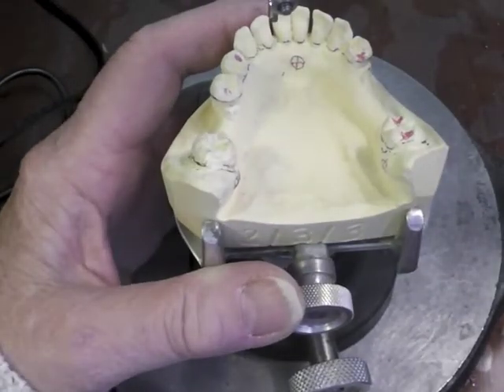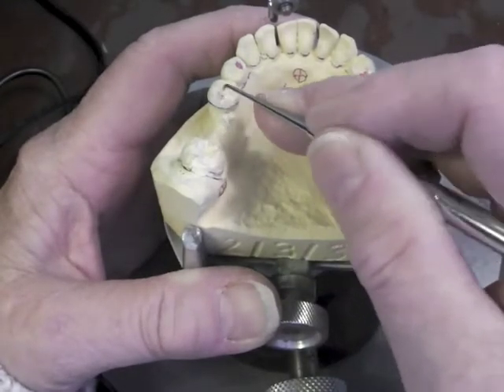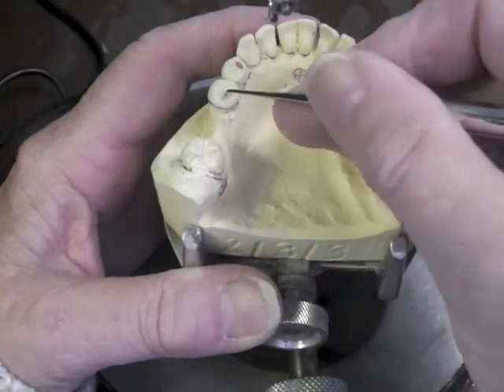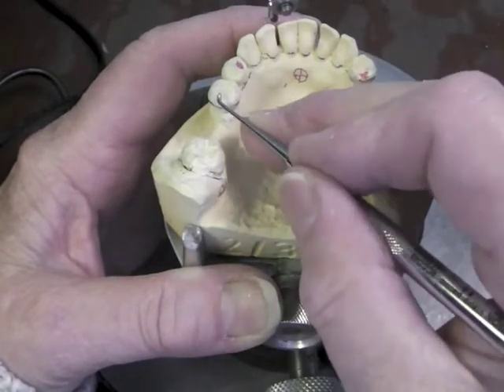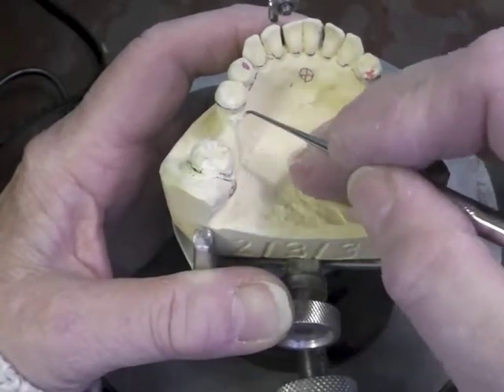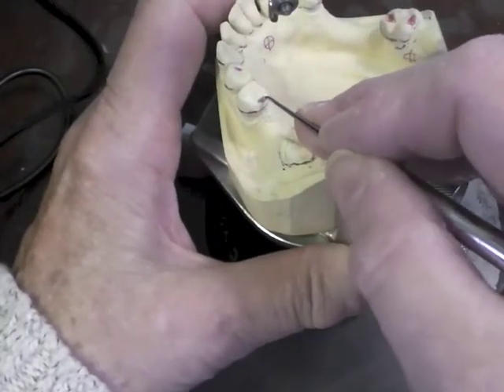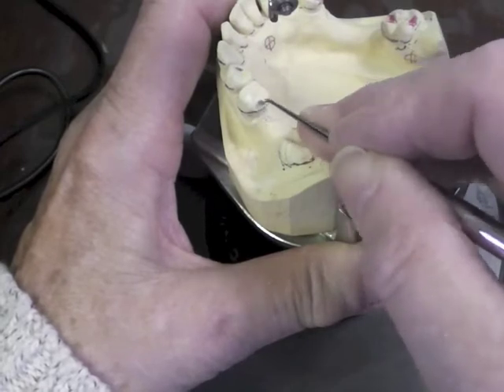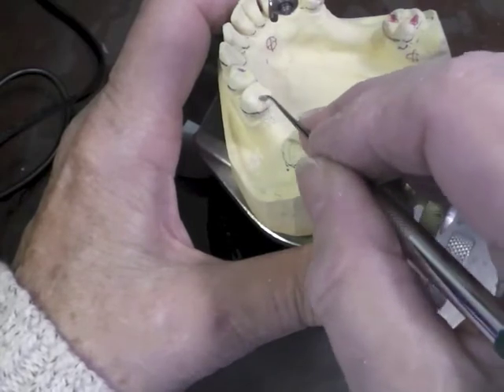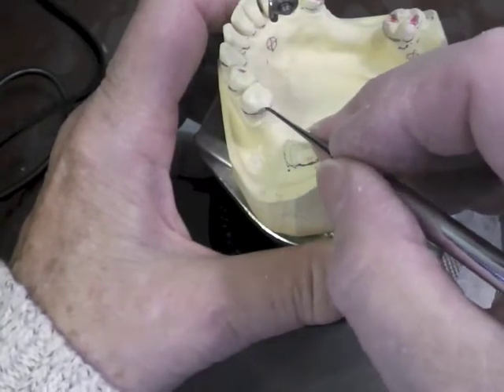Now I can go ahead and finish cutting my rest, which I had already started. I want a millimeter taken away at my marginal ridge. I want the fossa to be deeper than the marginal ridge. I'm going to have plating coming around this way, so I'm going to have a little bit of a sluiceway coming this way, and I'm going to have an arm coming in this direction. I'm trying to recreate the anatomy of this tooth — I don't want it sticking out back here — so I'm preparing a sluiceway for the metal arm to come around this way.